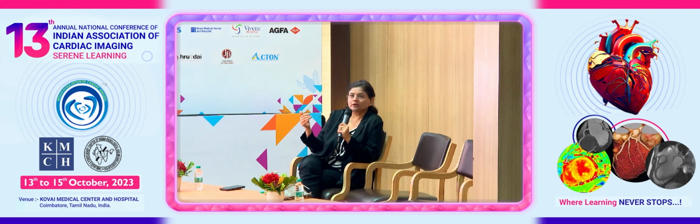It's not only along the course of the aorta and the peripheral vessels or the aortic valve or the aortic root, it's also everything else in the person. Sometimes there's a pheo that's been missed, or fibromuscular dysplasia that's been missed, which if one had some idea about, one would have been more careful. So when we're reading the TAVR, there are a lot of things outside the entire TAVR read, and that's where the radiologist comes in.